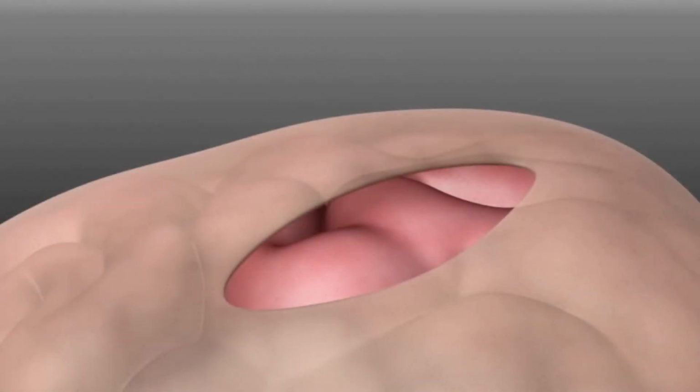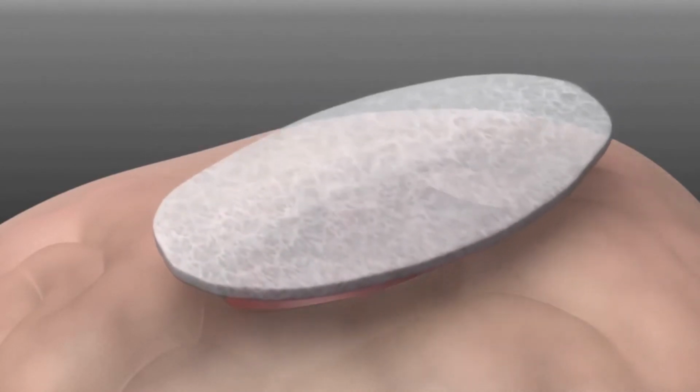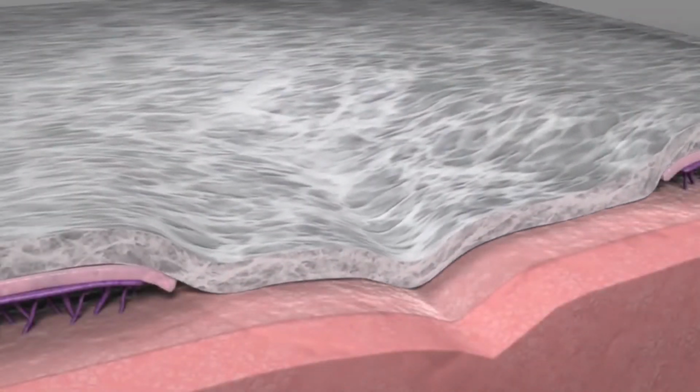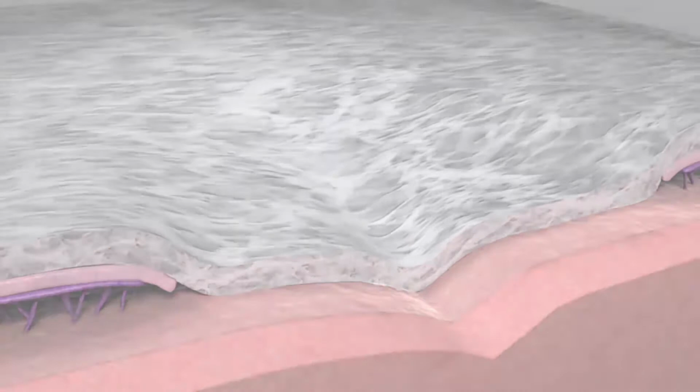Repairing a damaged dura with a DuraGen matrix is as easy as placing the graft directly over the defect. Once the graft hydrates, it becomes a pliable membrane that attaches to the existing dura via surface tension and fibrin clot formation, thus eliminating the requirement for sutures.